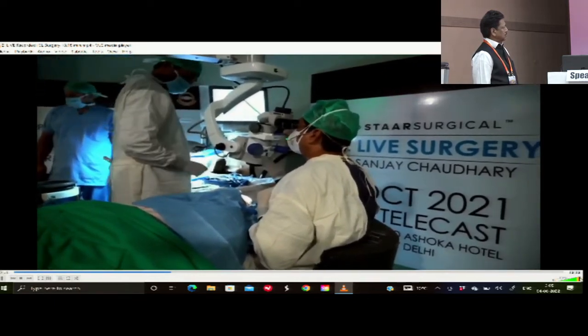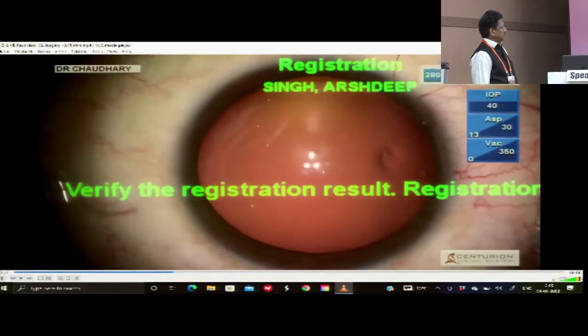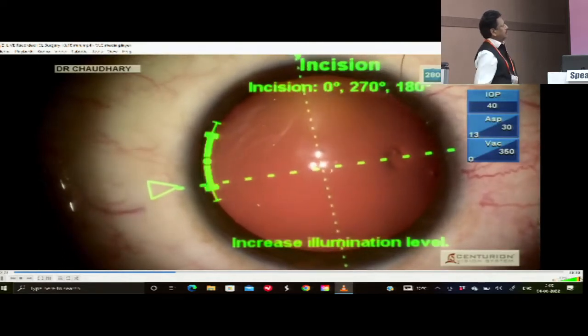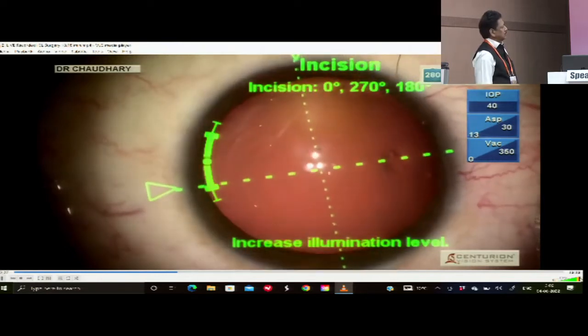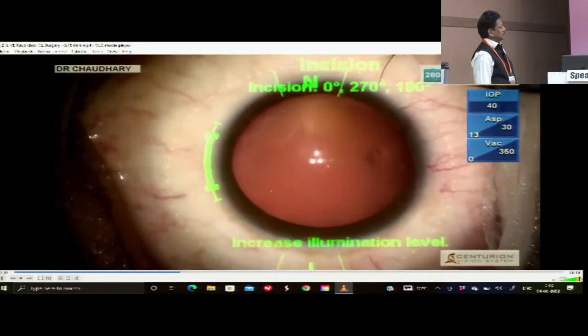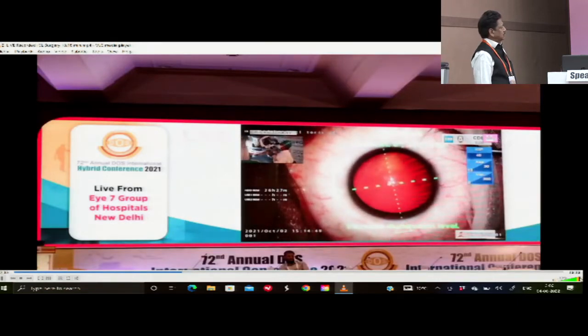So, capture karo. Yeah, Dr. Sanjay, I will just request you to keep on telling about the people who don't have Varion. Yeah. So they should do the marking. Perfect. Yeah. So the Varion has captured the data. I'll talk on both the sides. So Varion has captured the data, and if I reduce the magnification, you can see next.